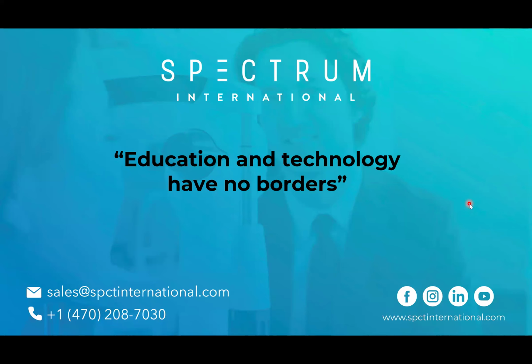They're asking us, Dr. Leonardo Africani from Colombia, are these attributes available in all versions of the Medmont? Ooh, that's a good question. I think that at Pacific University we asked Medmont to create the contact lens attribute in version 7. So certainly the Spectrum team can provide the attribute as an export file that you just import, and you can see if it'll work on version 6 or earlier. But I think it may only be a version 7 option.